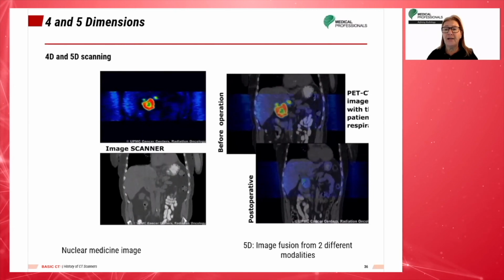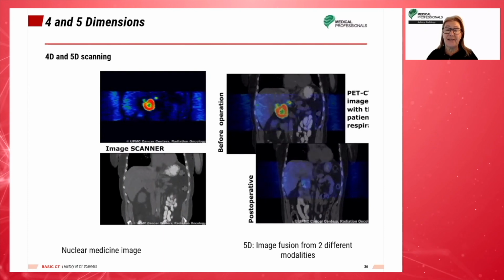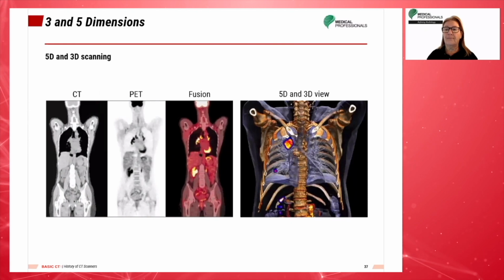This slide shows examples of 4D and 5D scanning. Moving forward, this slide shows different examples of 5D and 3D scanning. These are scans from CT, PET, fused image, and a 5D and 3D image for your comparison.